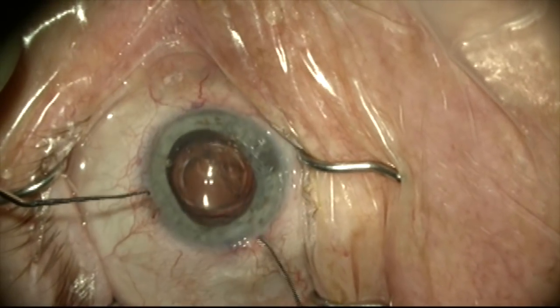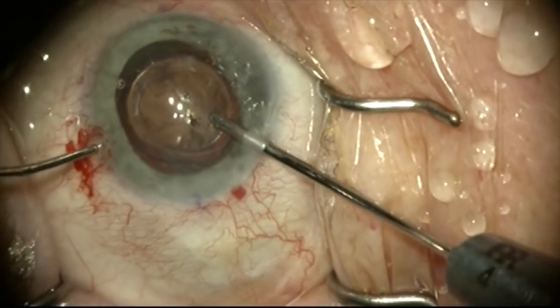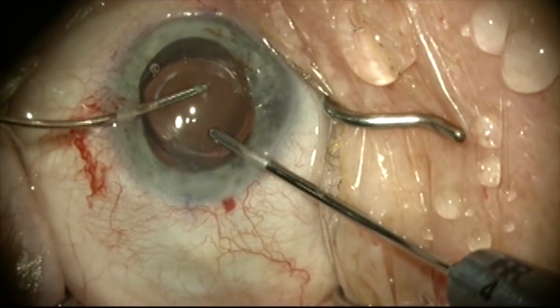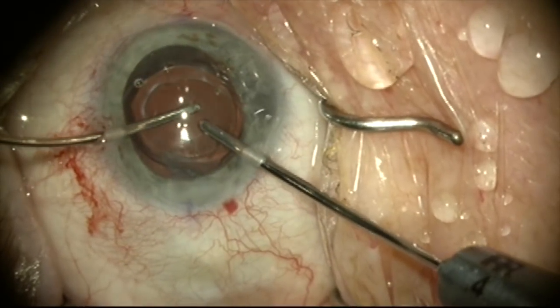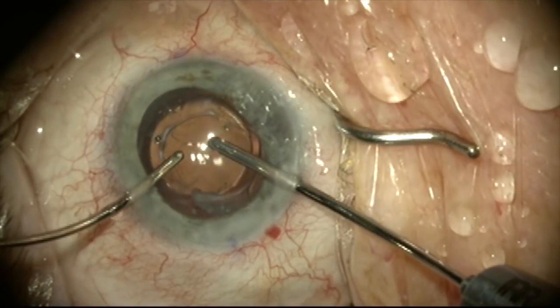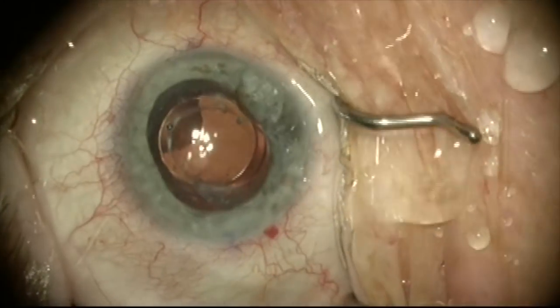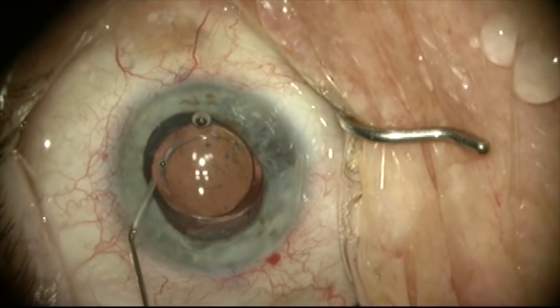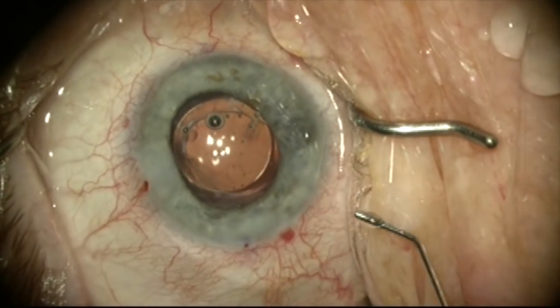I'm going to use a bimanual technique with separate irrigation and aspiration to remove the viscoelastic through the paracentesis. I feel this will give me better control and will be less likely to cause vitreous to come around a zonular dialysis underneath the main incision — I know that that is where the zonule is the weakest. With high flow through that incision, I'm concerned that vitreous could find its way around the capsular bag. I'm putting Miochol in here to bring the pupil down, and the case is now completed.